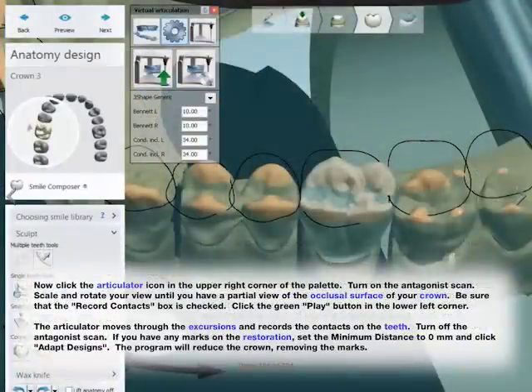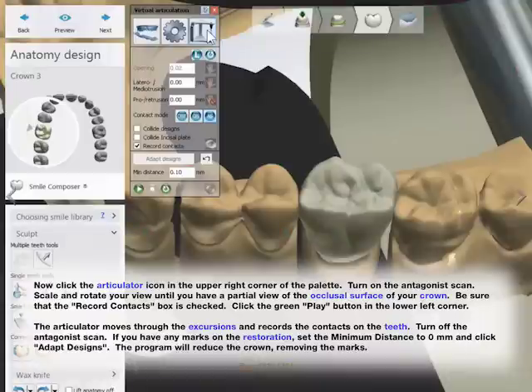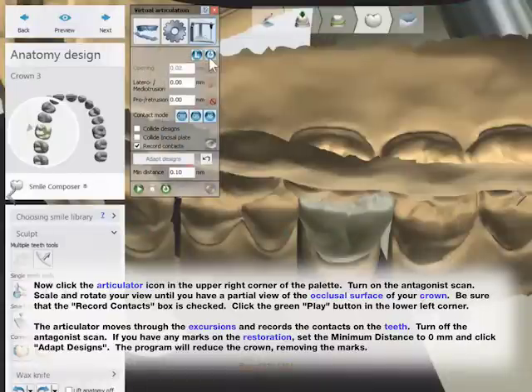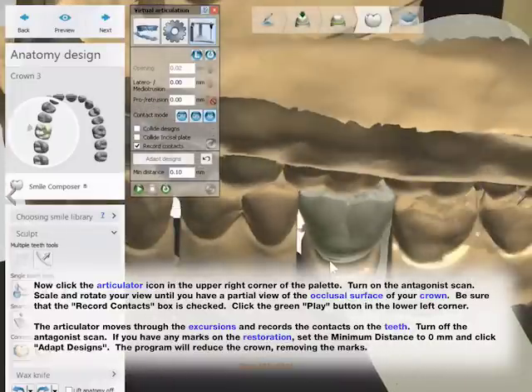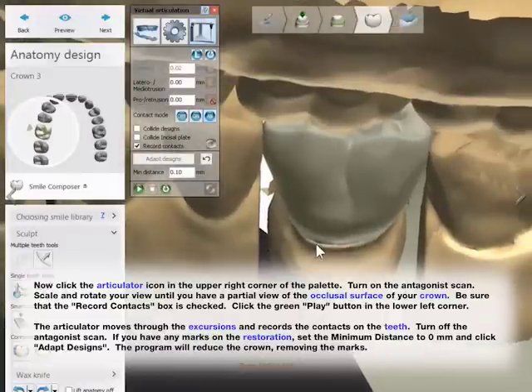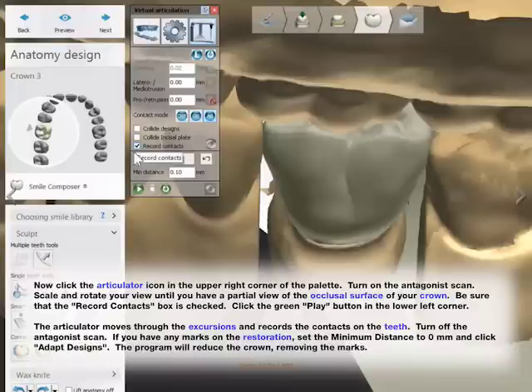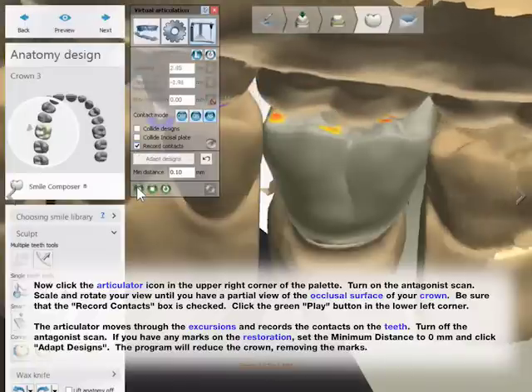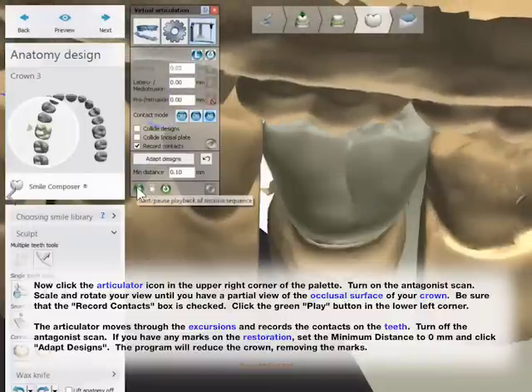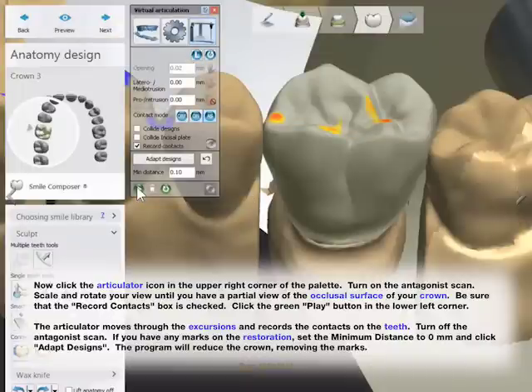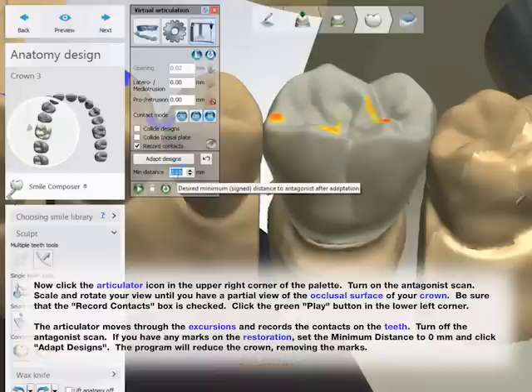Now click the Articulator icon in the upper right corner of the palette and turn on the Antagonist Scan. Scale and rotate your view until you have a partial view of the occlusal surface of your crown. Be sure that the Record Contacts box is checked, then click the green Play button in the lower left corner. The Articulator moves through the excursions and records the contacts on the teeth. Turn off the Antagonist Scan. If you have any marks on the restoration, set the minimum distance to 0 mm and click Adapt Designs. The program will reduce the crown, removing the marks.